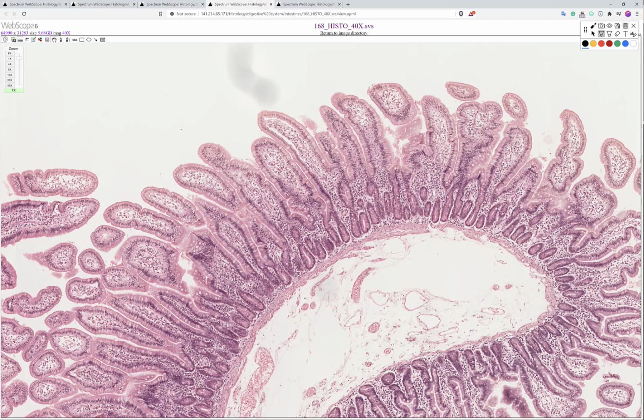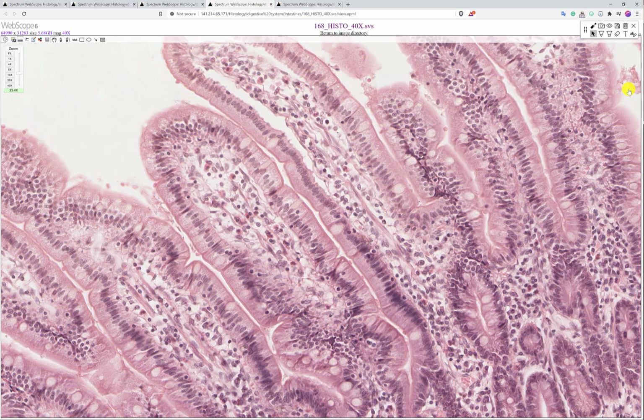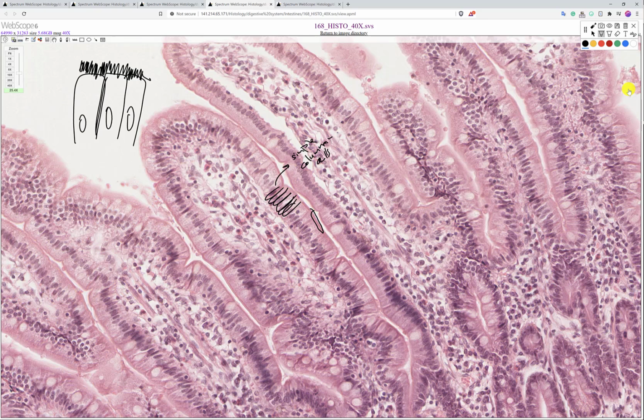If we zoom in more and look at the surface of these villi, we will see here that there are epithelial cells, and if you remember from AB1, these are simple columnar cells. Now the surface of these cells, like this area, if you remember, the simple columnar cells are tall cells, okay, with their nucleus a little bit down, but importantly on their surface they have extensions. These extensions are called microvilli, also to increase the surface contact of these cells, so the food can go in between these microvilli and be absorbed toward the cells.